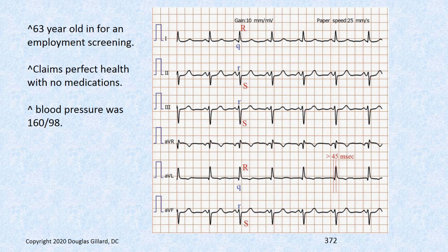63-year-old. Okay, great. What's the axis? Is it normal, first of all? Limb lead 1 will be upright. True. Limb lead, the peeper, will be upright. Where's the peeper? AVF. Oh, that's not true, is it? No, that's mostly negative. So no, the axis is off.